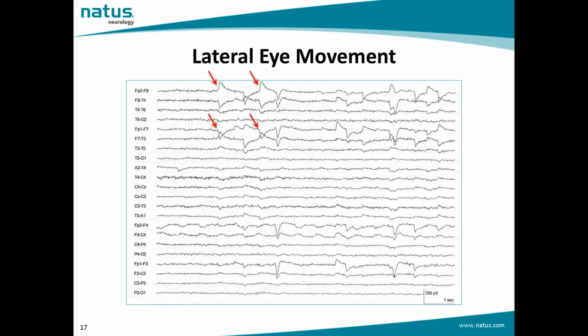Lateral eye movement most affects the lateral frontal electrodes F7 and F8, as the red arrows show in the picture. During the left lateral eye movement, the positive pole of the globe moves toward F7 and away from F8. Using a bipolar longitudinal montage, maximum positivity in electrode F7 and maximum negativity in electrode F8 is recorded. With the right lateral eye movement, the opposite occurs. The so-called lateral rectus spikes may be present in electrode F7. It's observed best in the vertex reference montage.